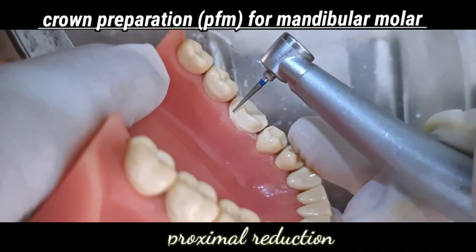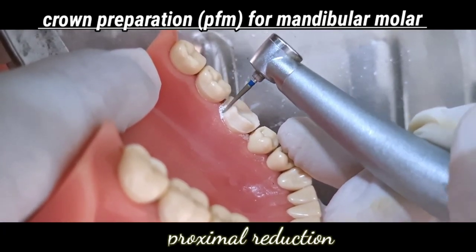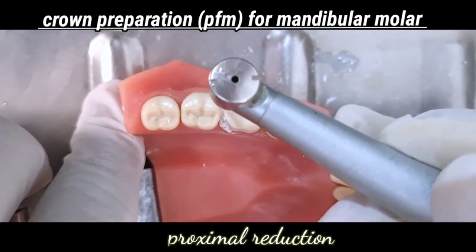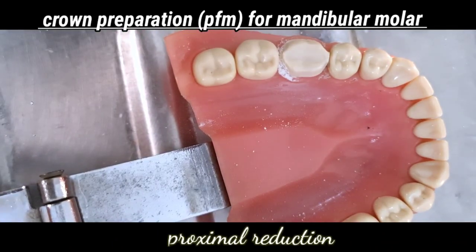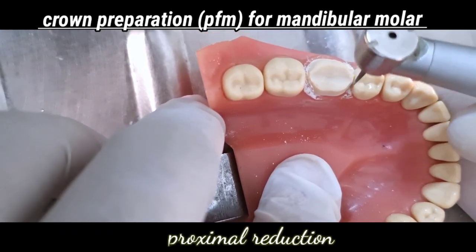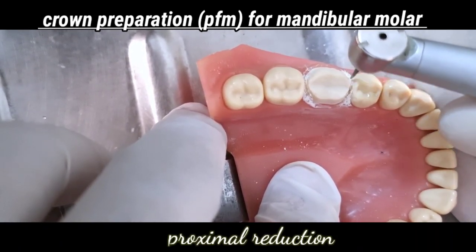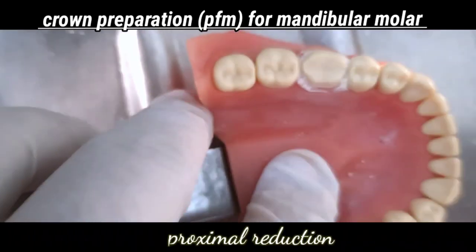Following the buccal and lingual reduction, now proximal contacts are to be opened. This is one of the trickiest areas to prepare, and good hand skills are important. At this point, don't attempt to make a marginal line. The goal in mind should be only to open interproximal contact without damaging the adjacent tooth. And for this purpose, you can place a matrix band to avoid any iatrogenic damage to the neighboring teeth.